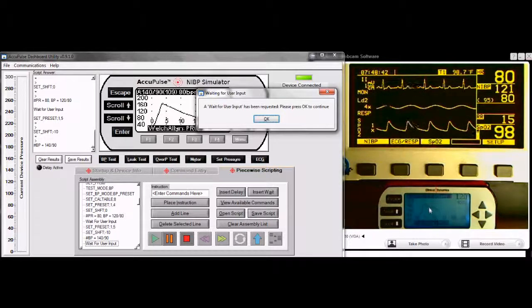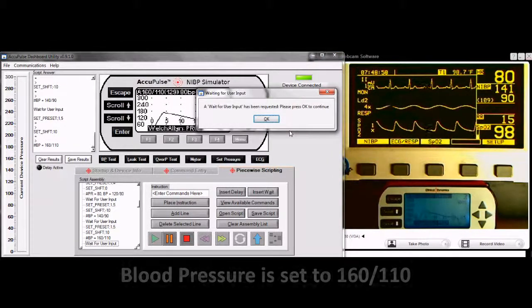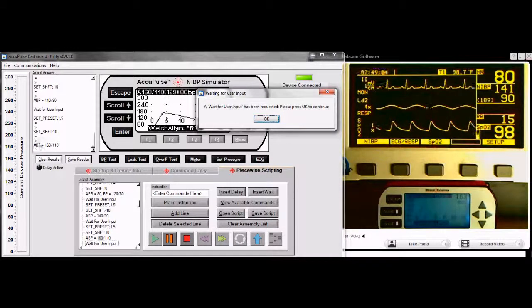Typical clinical scenarios include orthostatic physiologic changes, hemodynamically stable and unstable cardiac arrhythmias, identification of categories of shock, hypovolemic shock, septic shock, and cardiogenic shock, and hypertensive crisis.